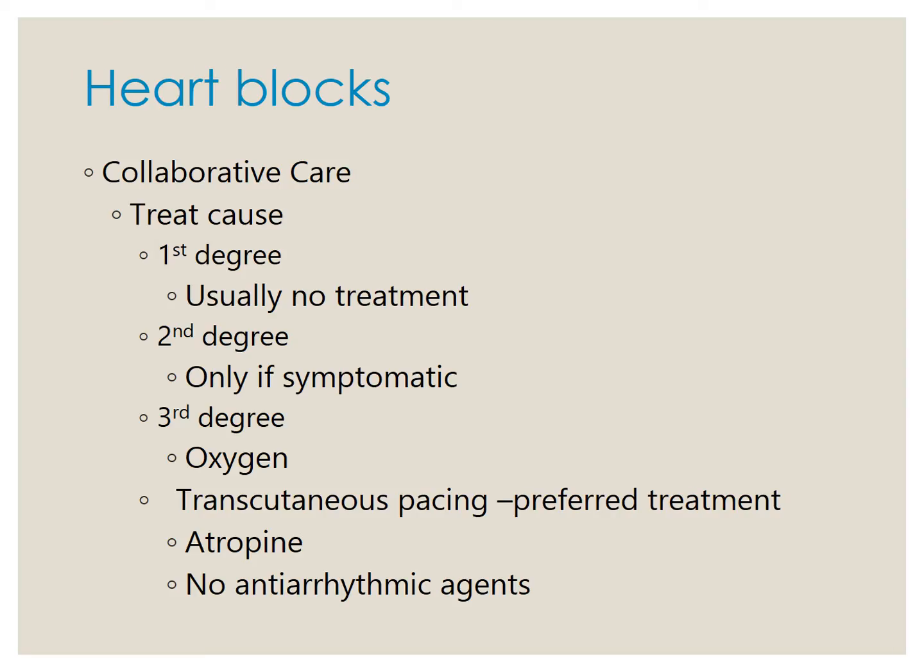Okay, so nursing interventions and care. If you see a heart block, you want to observe for lengthening of the PR intervals or development of a more serious heart block. You want to treat the cause. So if you see somebody that's having symptoms and they have a heart block, it could be from a drug toxicity.